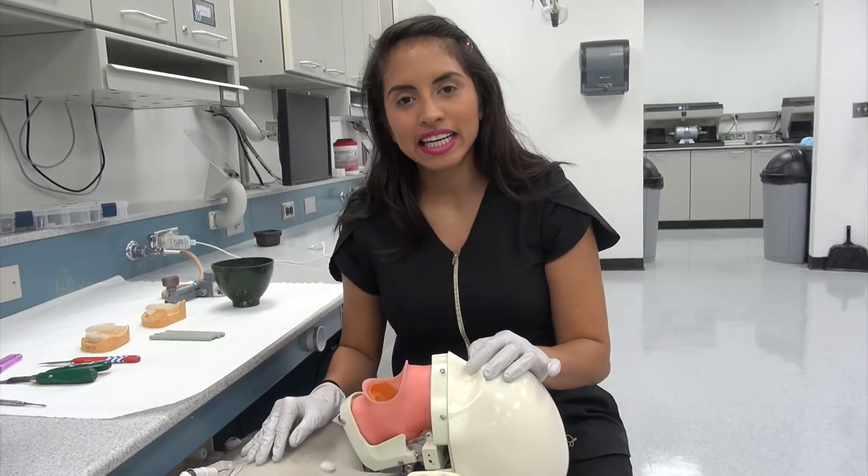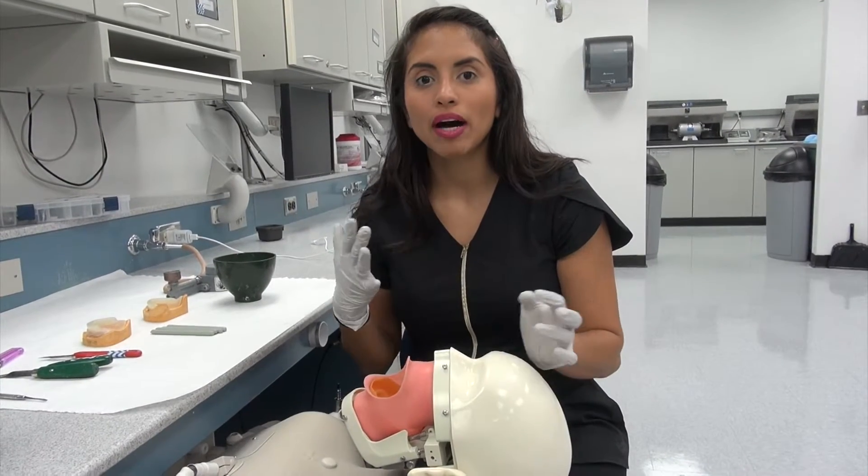Hi, I'm Stephanie Lomeli, and today I'm going to be showing you about border molding.